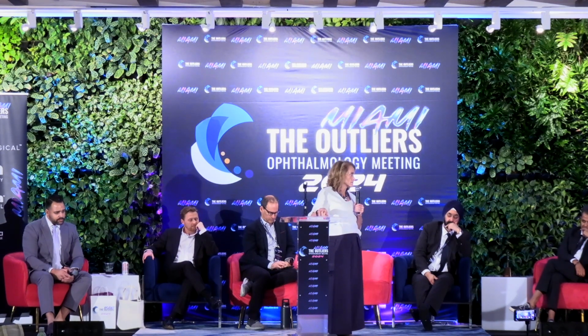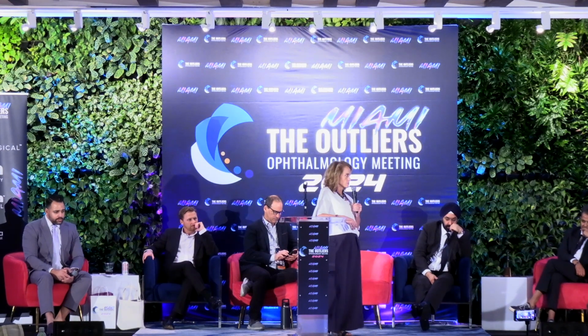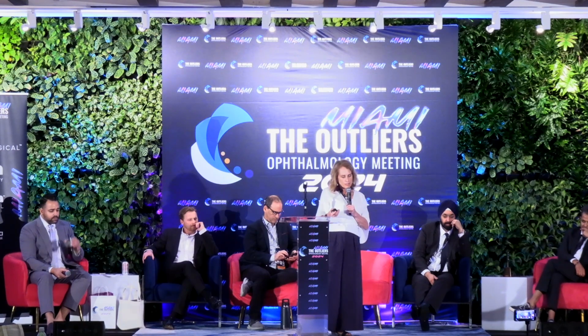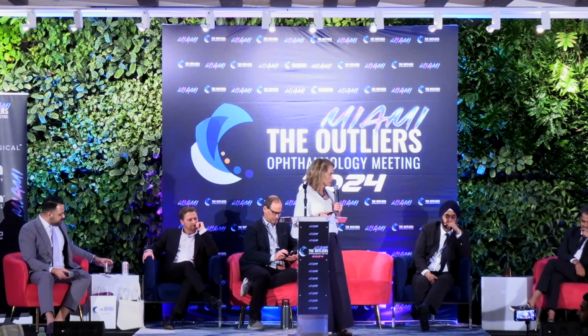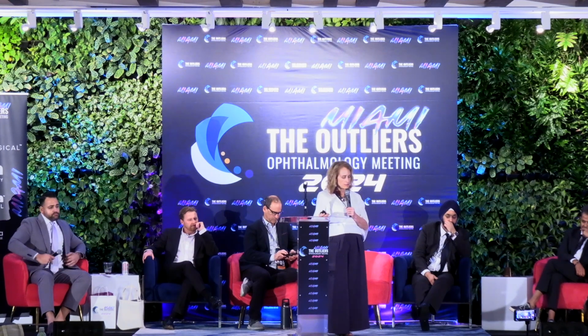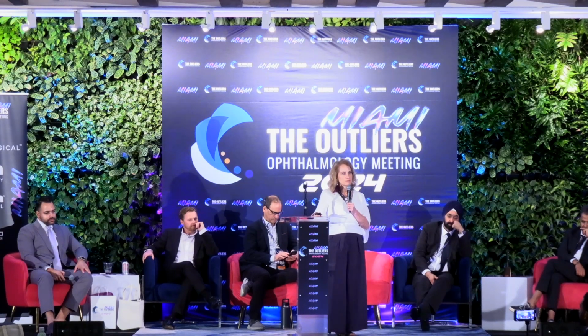If we look at what the ASCRS committee came up with for their algorithm, we want patients out of their contact lenses, and we want them not to be using drops, so we're not biased in what we're looking at, and it's not masking some of what we can see at the slit lamp. But part of that is not just their SPEED questionnaire, we use the dry eye questionnaire, but it's also tear osmolarity and maybe inflammatory markers too. Depending on that, you can talk to the patient about whether or not they have dry eye disease. So what does it do? Why do we care about hyperosmolarity? Well, it makes a difference in our accuracy with our planning for patients.